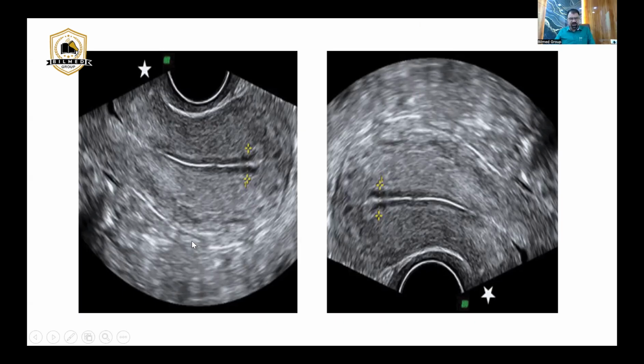Anyhow, coming to the question, this is anterior, this is posterior, and if I have not flipped the picture, if I have not pressed the invert knob, right and left will remain same, and superior and inferior will remain same. But I have to see whether I have rotated it clockwise or anti-clockwise, like in abdominal ultrasound.